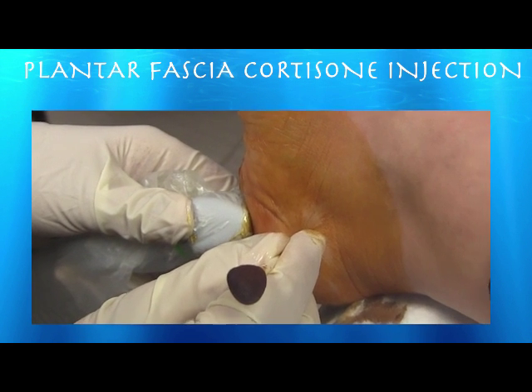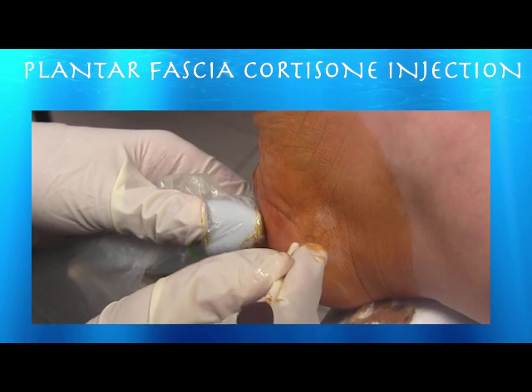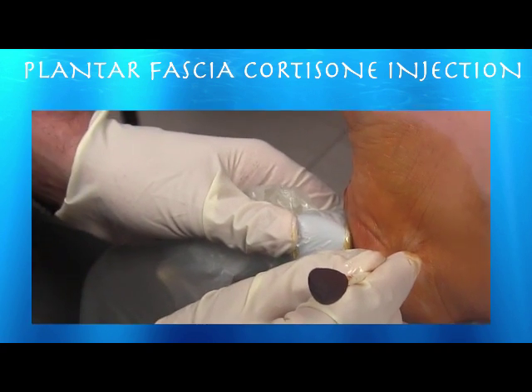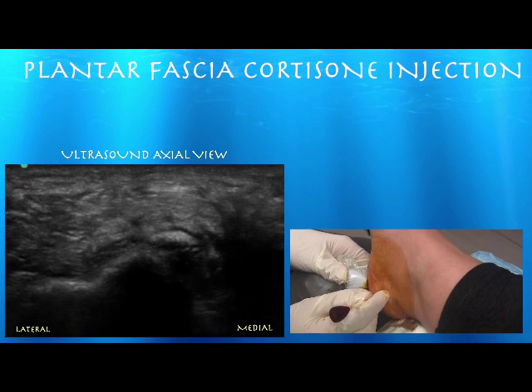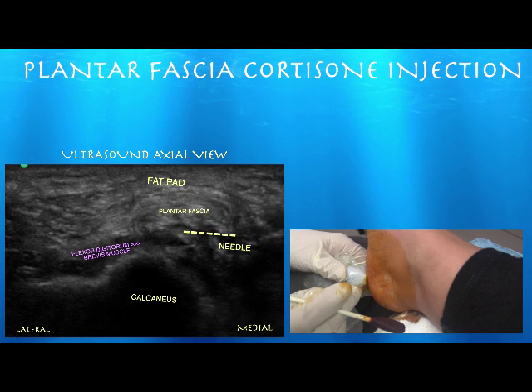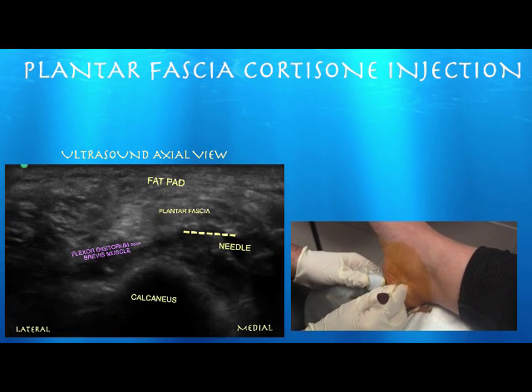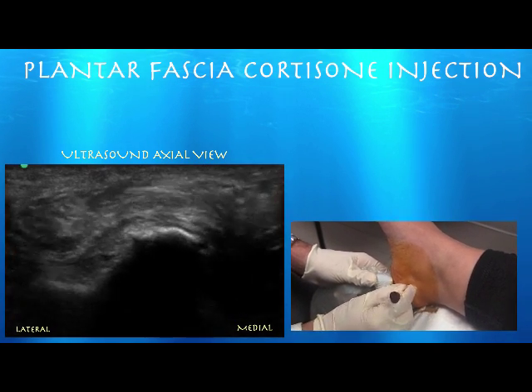We're going to try to get our needle between the plantar fascia and the calcaneus. You want to make sure you don't go too superficial — you don't want to put your needle here and wind up in the fat pad. You really want to go deep and basically have your needle go right over the spot where she is tender. Here I am pushing on the skin on the medial aspect of the foot and you can see the planes of the fat and the plantar fascia roll over each other. This is a good way to delineate the plantar fascia from the fat pad — your target is under the plantar fascia.